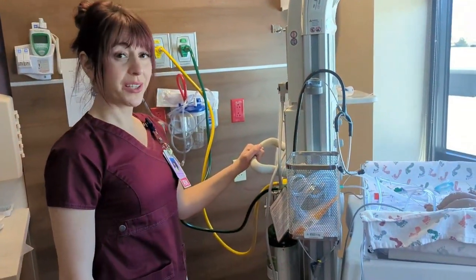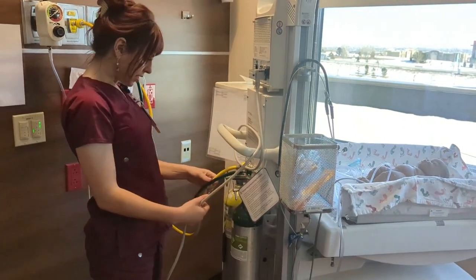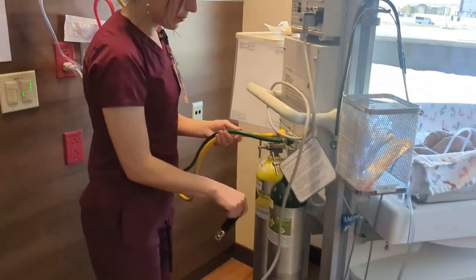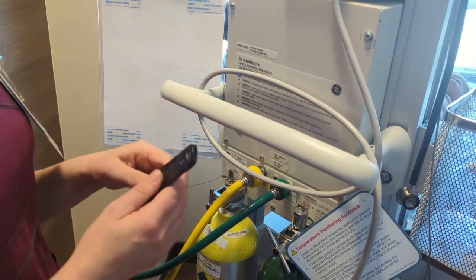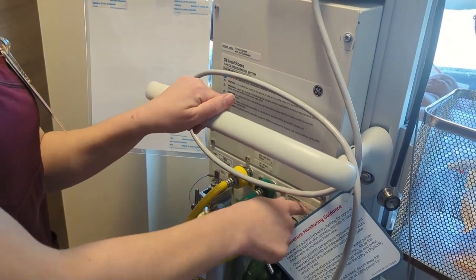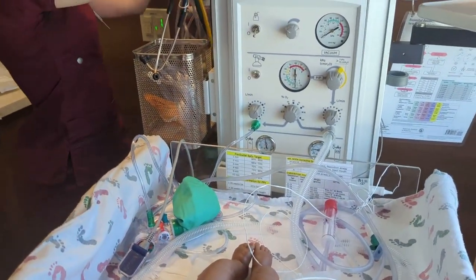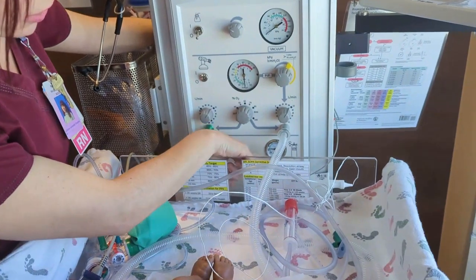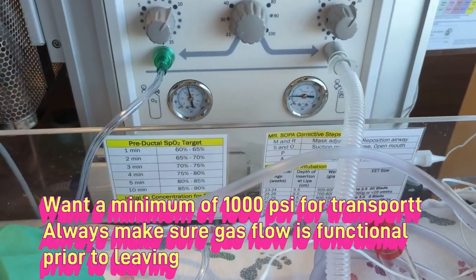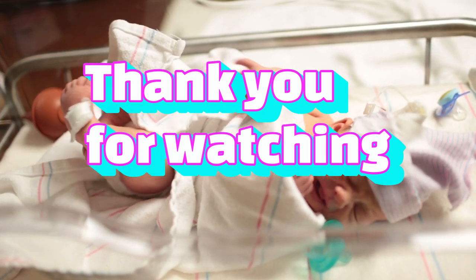When we're ready to transport the baby — leaving the room and taking the baby in the warmer — one thing we'll need to do is open up our tanks. Take one of these keys and give it about a quarter or a half turn. Then unplug the baby from the wall. We want to make sure our tanks are okay. It does look like our air tank is a little low for transport.